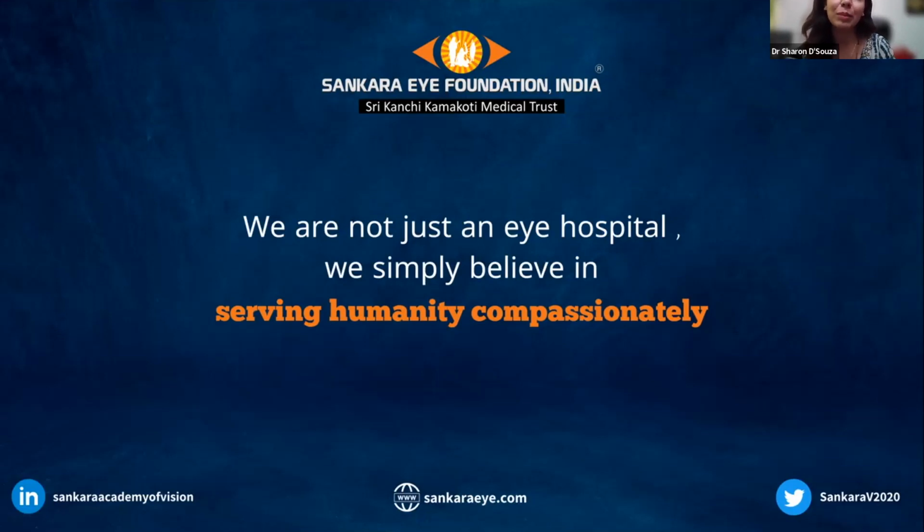When you're doing the tear breakup time, would you like to take one reading, or a few repeated readings? Usually I take 3 readings, ma'am. Actually, it is my thesis topic also. For all the patients which I have checked, I took 3 readings, and the average of... Correct. So you'll take the average of 3 readings.